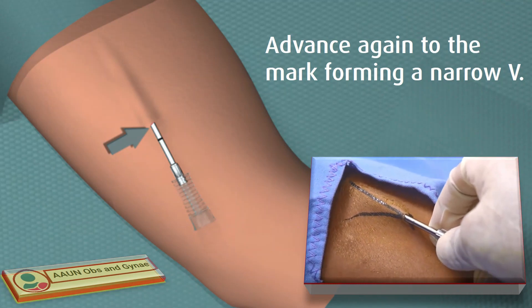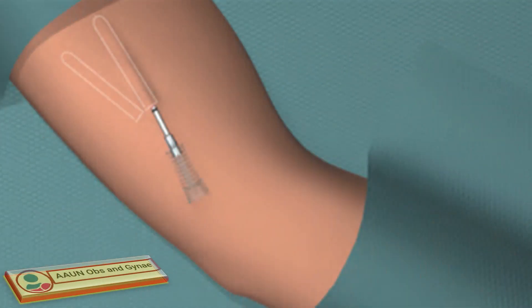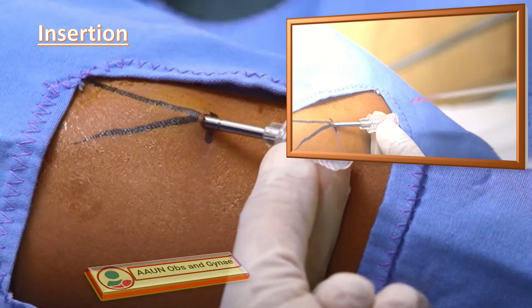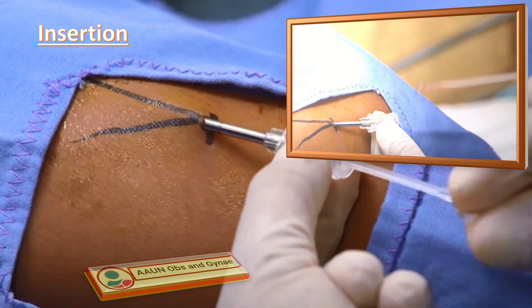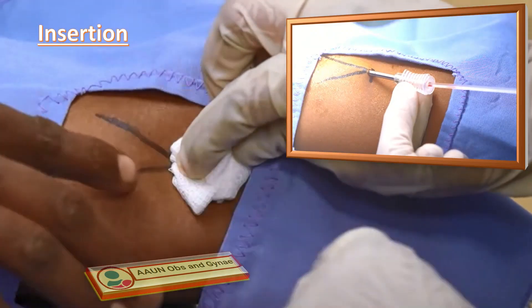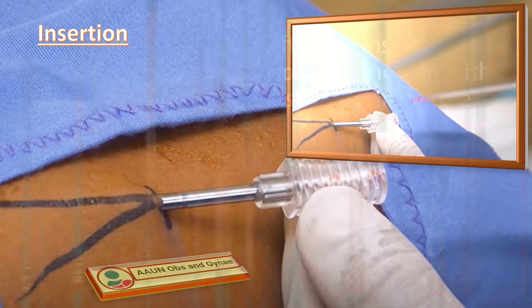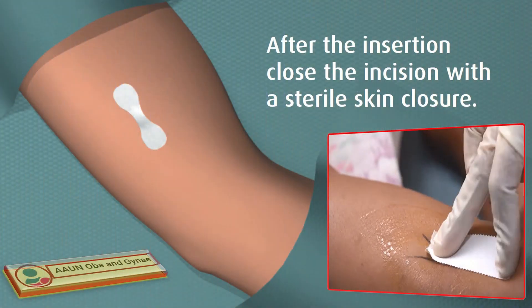Advance the trocar again to the mark, forming a narrow V shape — as you can see in this video. Remove the plunger and load the second implant. Insert the second implant next to the first one to form a V shape. Fix the position of the first implant with the left forefinger and advance the trocar along the side of the finger to ensure a suitable distance between the two implants and prevent expulsion. Leave a distance of about 5 mm between the incision and the end of the implant, and check correct position by careful palpation.